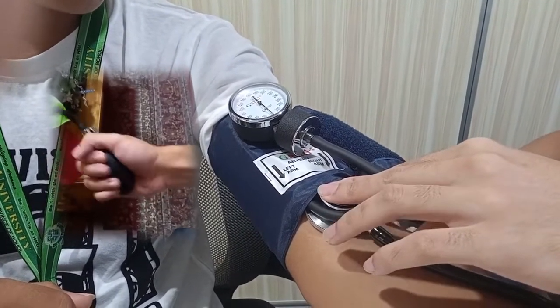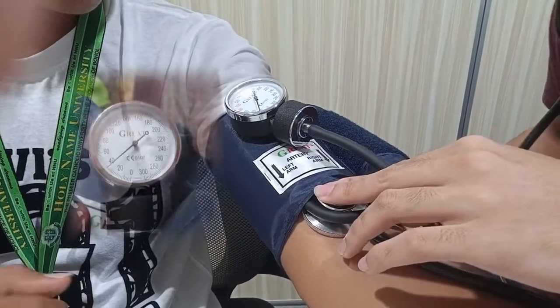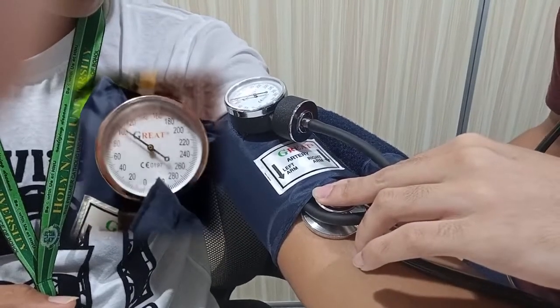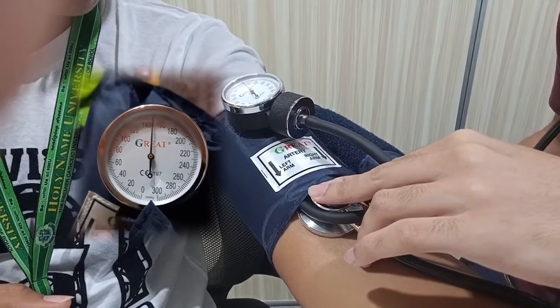Fourth, watch the gauge. Keep inflating the cuff until the gauge reads about 30 points above your expected systolic pressure. At this point, you should not hear your pulse in the stethoscope.